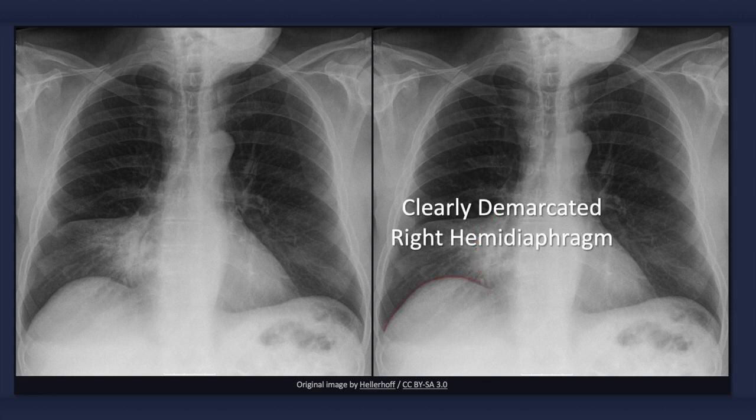Note that the superior border of the right hemidiaphragm is clearly defined. This helps to differentiate a right middle lobe pneumonia from a right lower lobe pneumonia, in which case the right hemidiaphragm would be obscured.